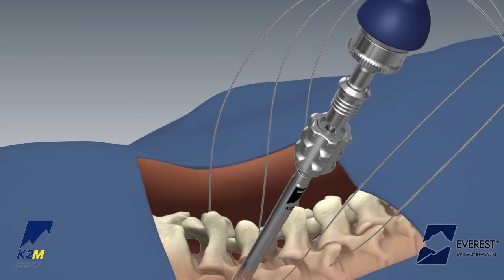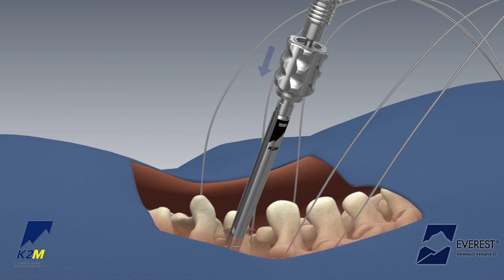Once the screw is satisfactorily positioned, pull down on the thumb knob of the Everest MIXT screw inserter to disengage the locking feature. Rotate the thumb knob in a counter-clockwise direction to detach from the implant.